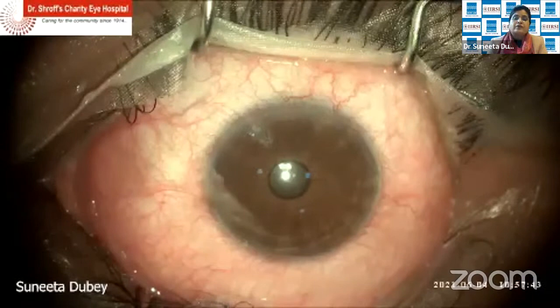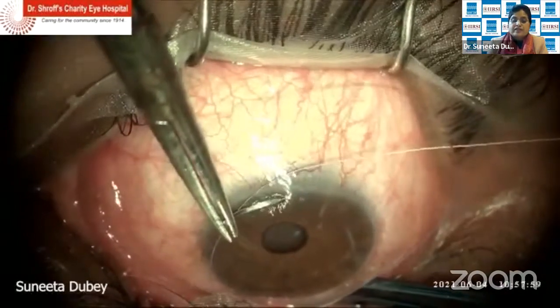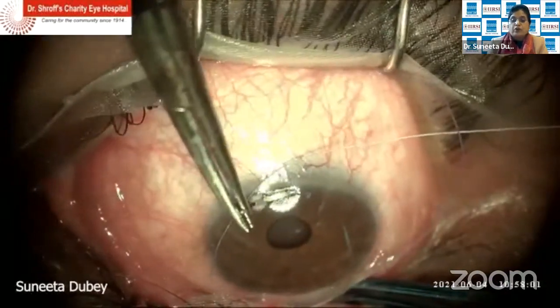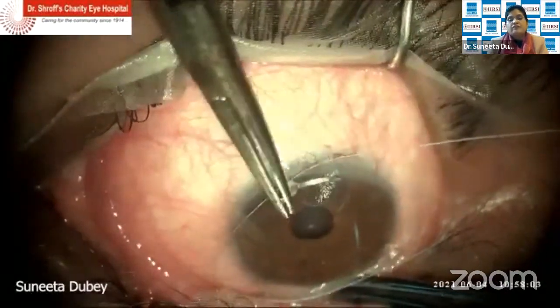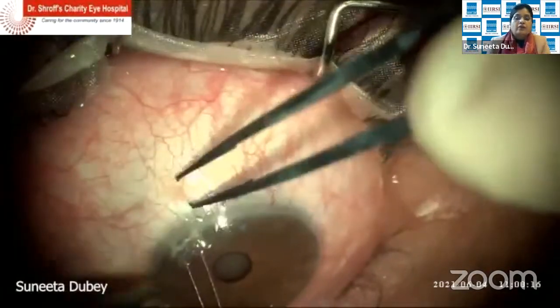So what are the indications of limbal based flap in your... I think we'll just run a little bit of it. Yes, yes. So now coming to the first step, the exposure of the operating site. So what kind of traction suture you would apply, whether it will be corneal traction?